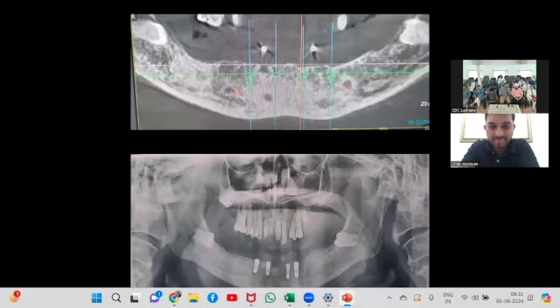And yes, this is the position. We had to shift one implant a little mesial. That was the left mandibular premolar, because it was coming a little closer to the foramen in clinical evaluation. So we got a pretty good result, and this just got finished last week. We'll follow up the later steps as we develop. So that is two small cases from our side. Thank you.